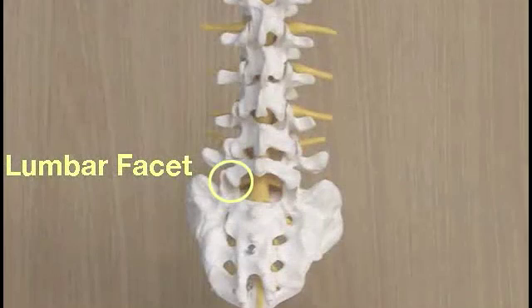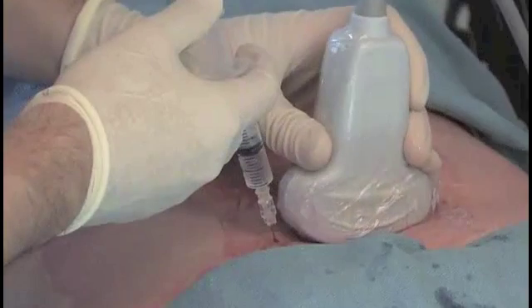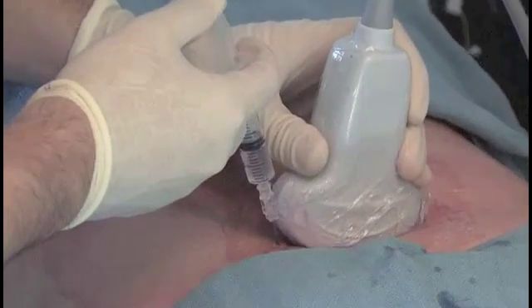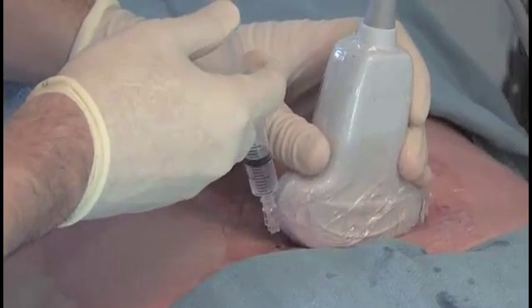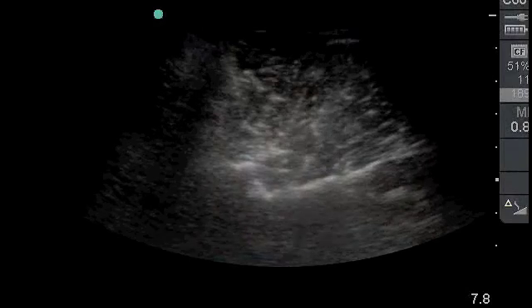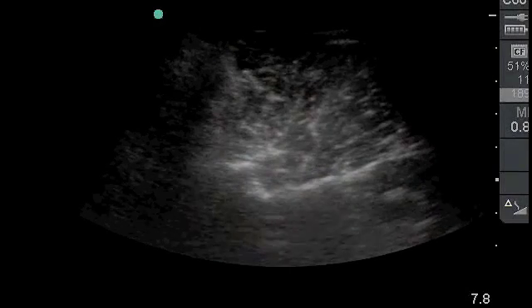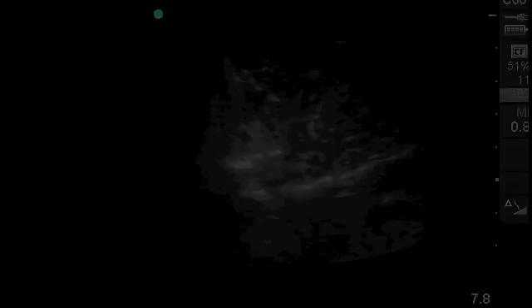Lumbar facet, or zygapophyseal joint pain, is a fairly common cause of low back pain in certain subsets of patients. Lumbar facet joint injection is both a diagnostic and therapeutic procedure. Ultrasound guidance allows for direct visualization of the lumbar facet without fluoroscopy.